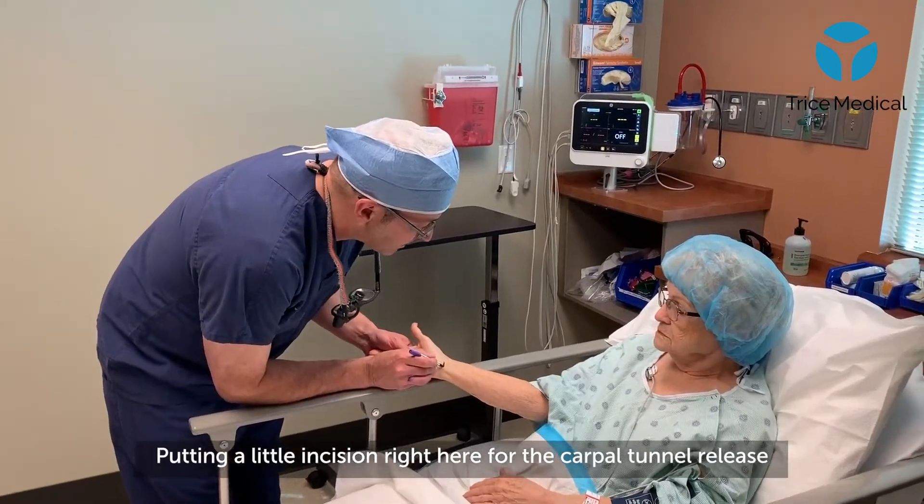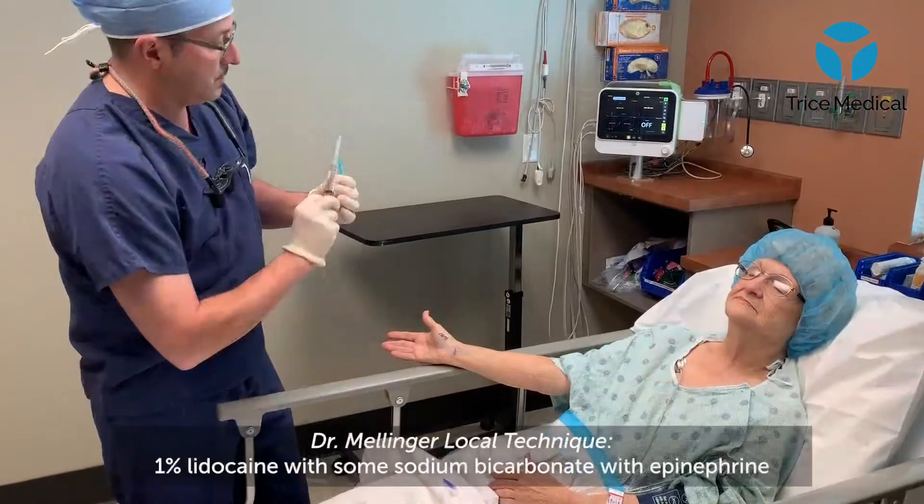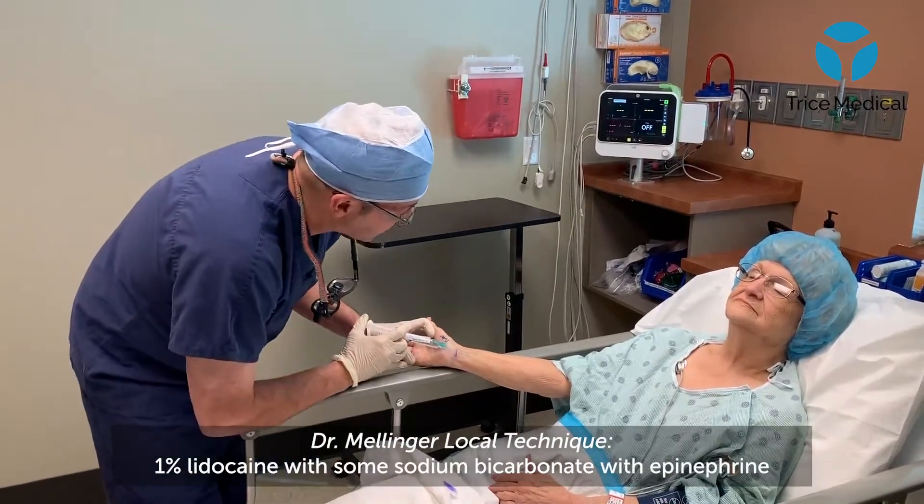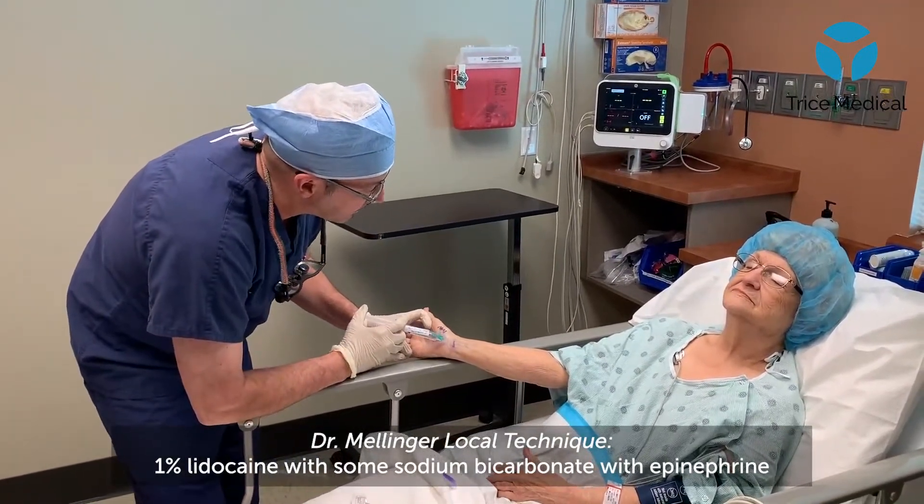We're going to do a little incision right about here for your carpal tunnel release. We're using a little 1% lidocaine — it's got a little sodium bicarb and epinephrine in it.